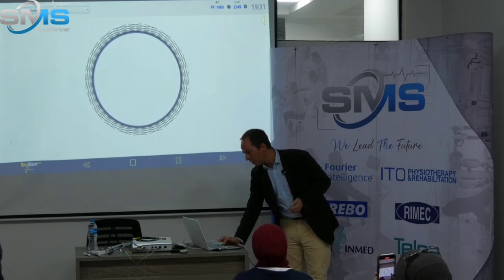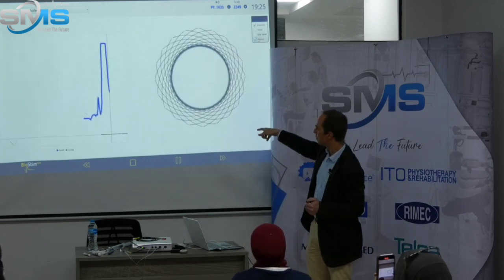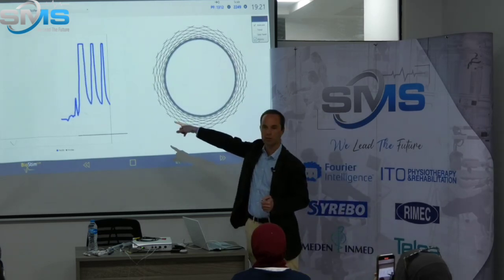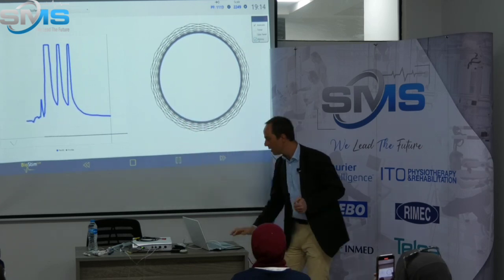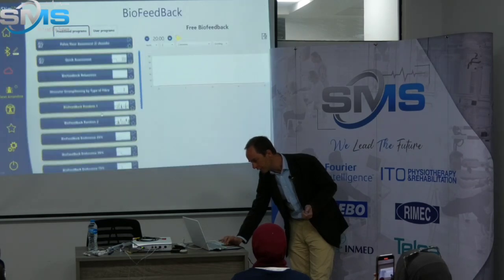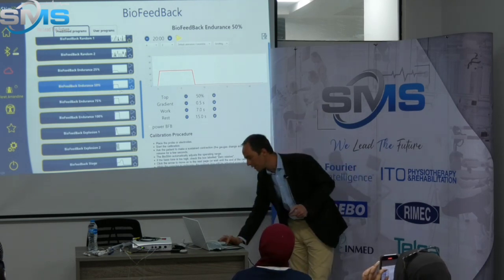Once it works, you can have both kinds of design on the same screen, and then she can see what's going on and how she will see it for other exercises, because we'll need this kind of visualization for the other exercises. Because now my patient contracts correctly, I can start an exercise. Let's say she has a problem with slow twitch fibers. I will select this program.